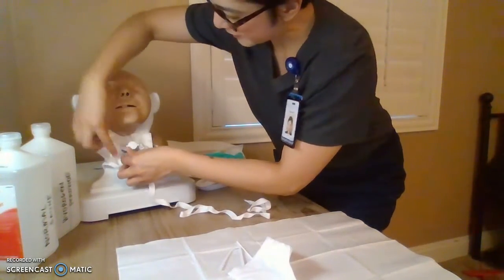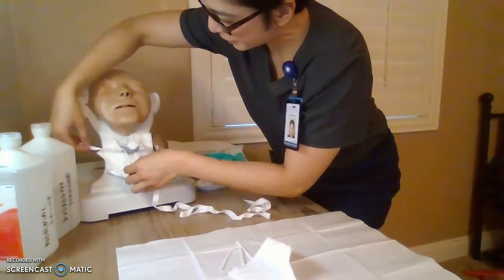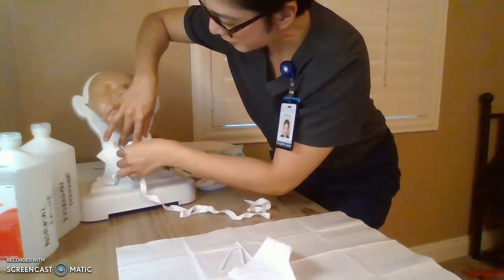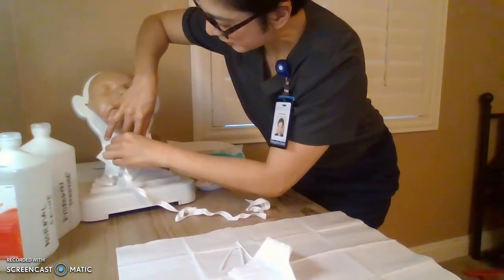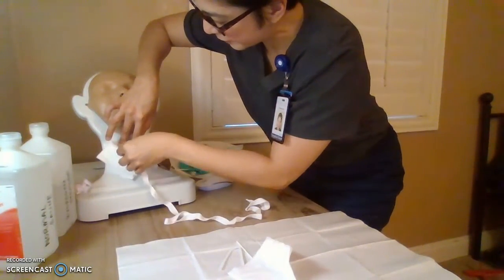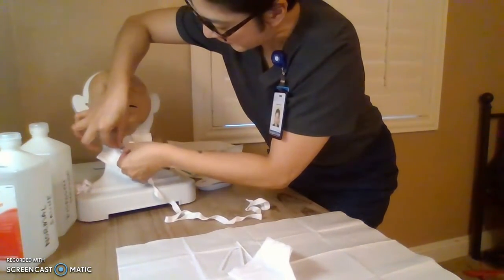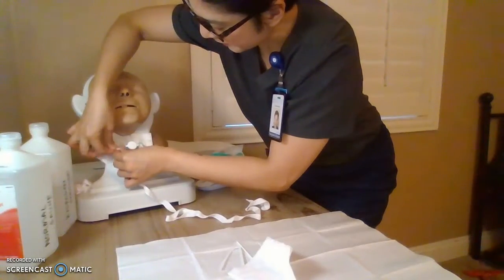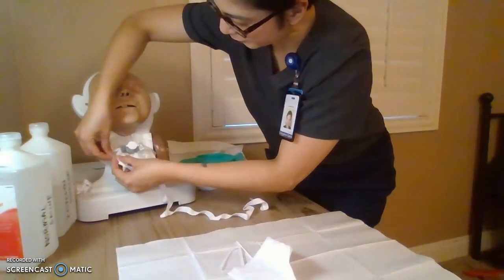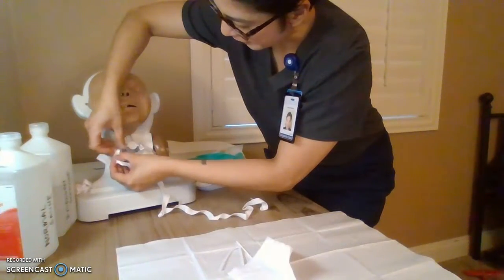So assess your patient. We're now going to remove the first tie. Reinforce, stabilize your trach. We're going to remove this side. Okay, you're going to insert this one on one side. And now you see the buttonhole. You're going to thread this through that.